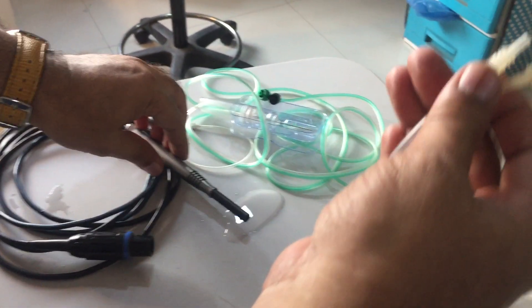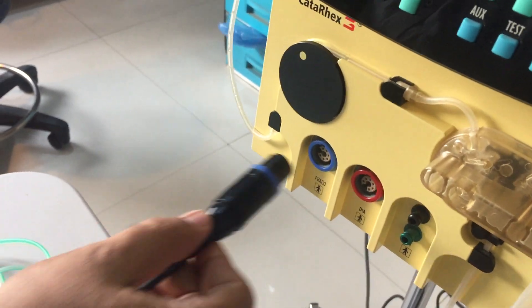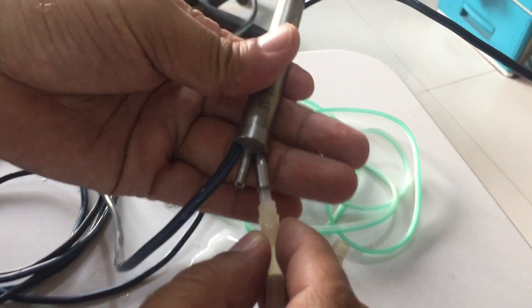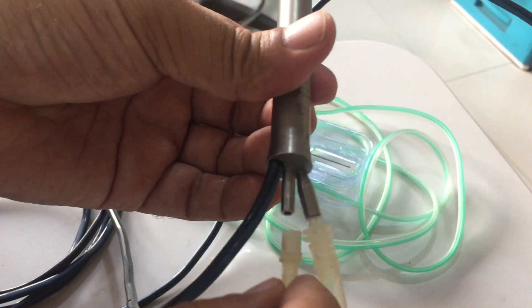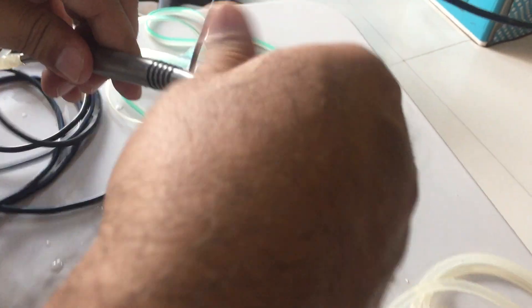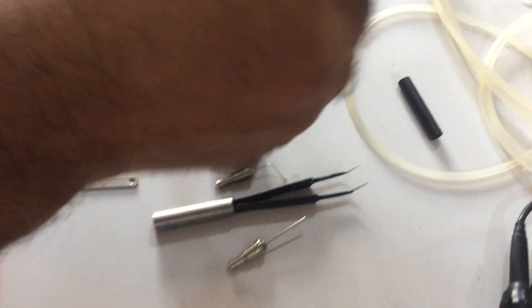Then you connect the FECO handpiece with the machine, and then you connect the irrigation and aspiration tubing with the FECO handpiece. Then you open the cap of the handpiece. Here is the regular tip inside — this is the protector with tip.